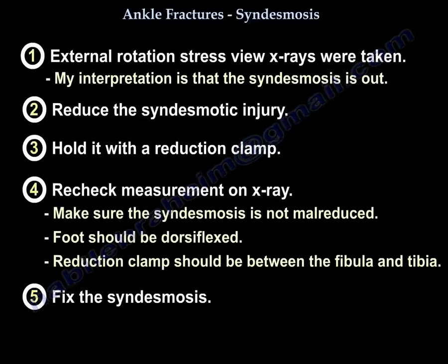I did the external rotation view and my interpretation is the syndesmosis is out. Now I'm going to reduce it. I'm going to use the reduction clamp and recheck my measurements again — I want to make sure it's not malreduced. My foot is dorsiflexed and the reduction clamp is between the fibula and the tibia. Now I'm going to fix the syndesmosis.